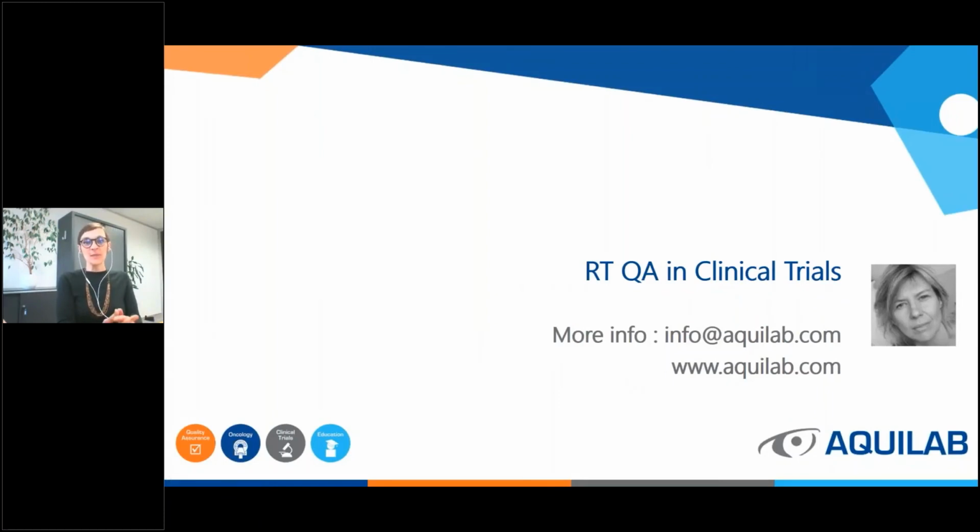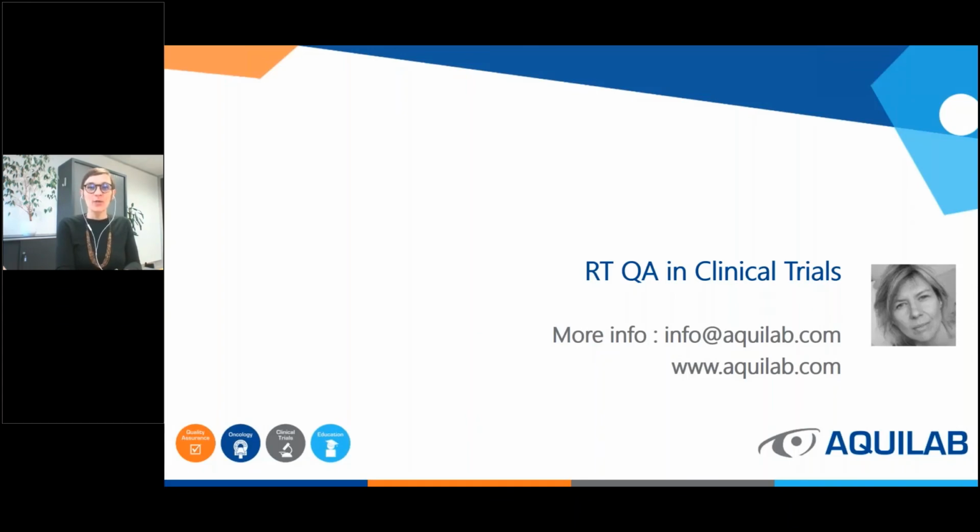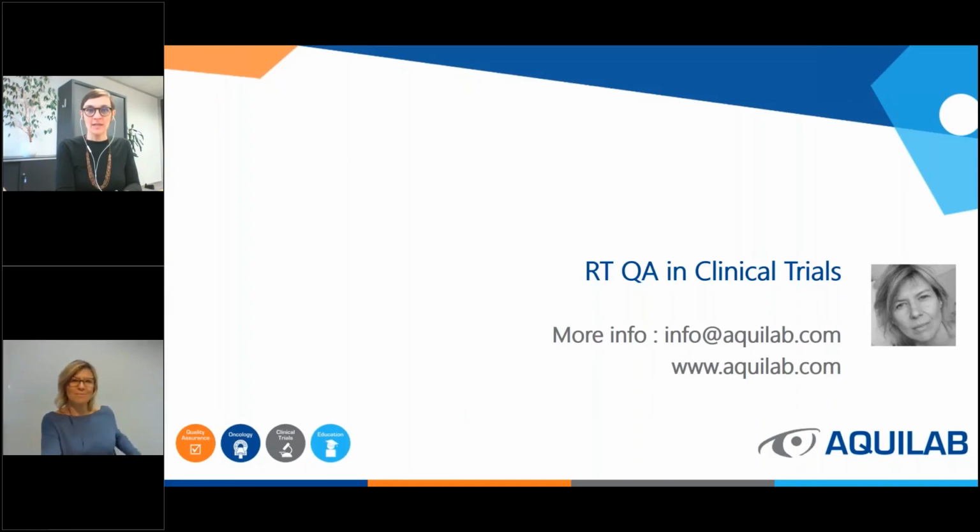So we can now answer some questions maybe from attendees. So the first question that we had is it possible to review imaging on your platform? Oh yes, of course. We focus on this demo in the radiotherapy data, but all imaging data can be populated in this platform, imaging for diagnosis or for follow-up to be compared in this platform Share Place.